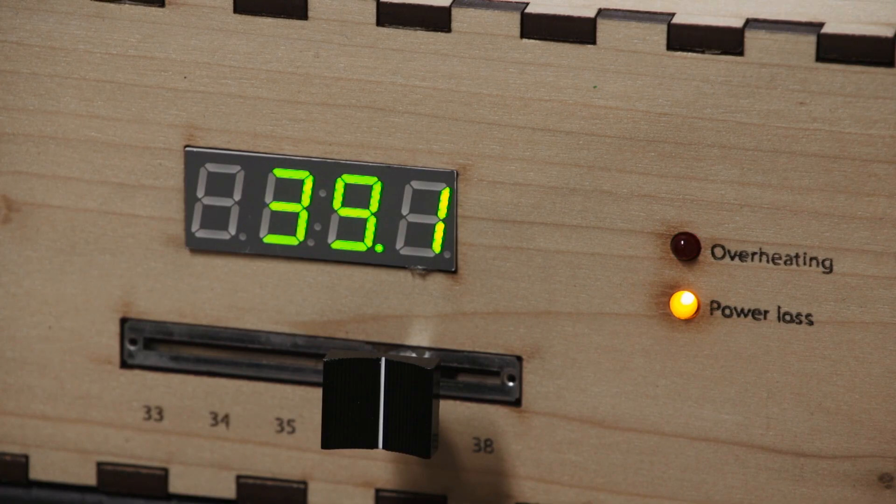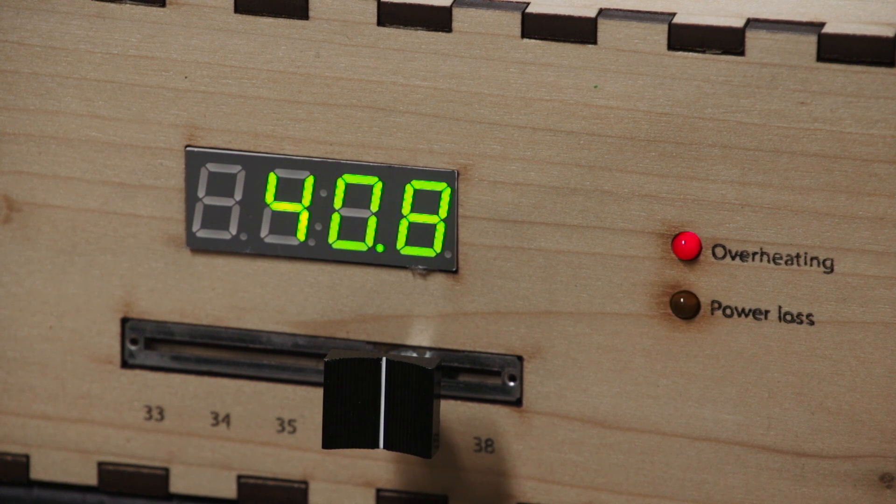Should something go wrong — either the neonate overheats or a probe gets disconnected — alarms will sound along with LEDs to alert the care provider to attend to the neonate.